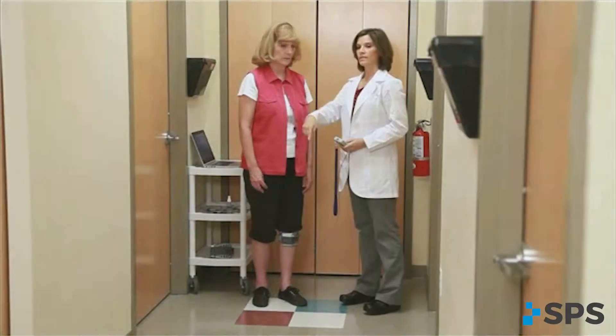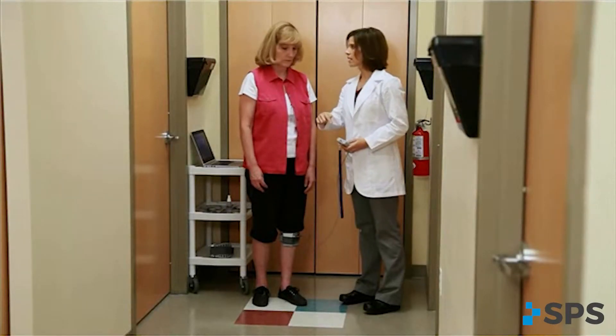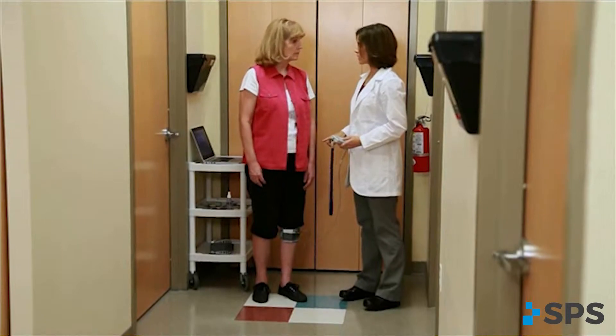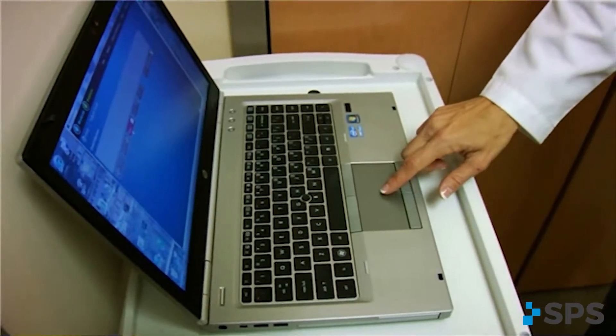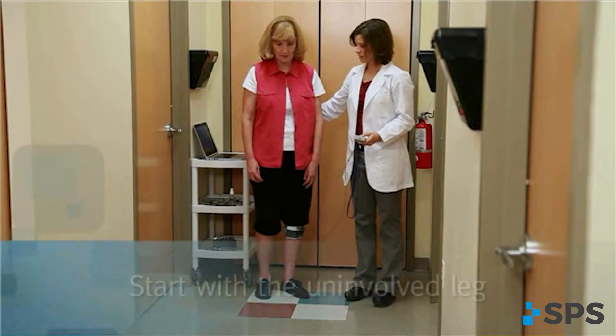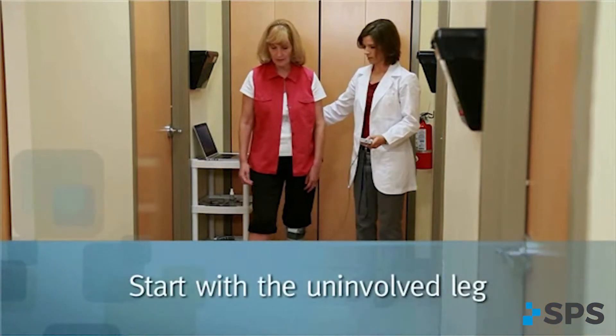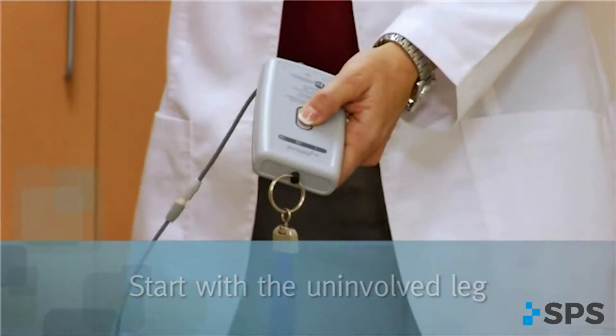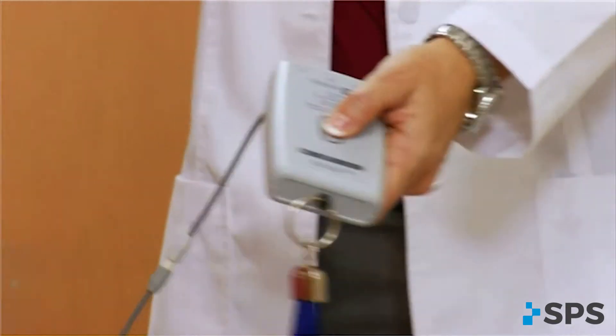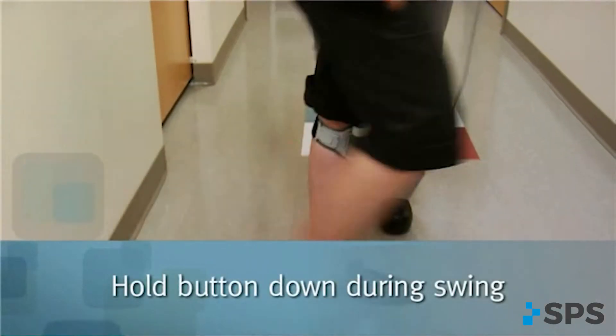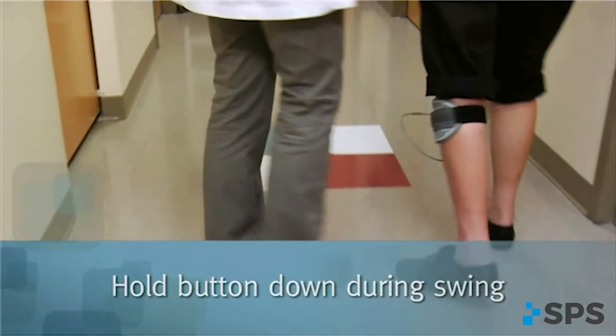Give the patient very specific instructions and explain what you will be doing. Click start on data collection. Instruct the patient to take the first step with the uninvolved leg. Apply manual stimulation via the WalkLink with every step, holding the button down through the entire swing phase of gait.